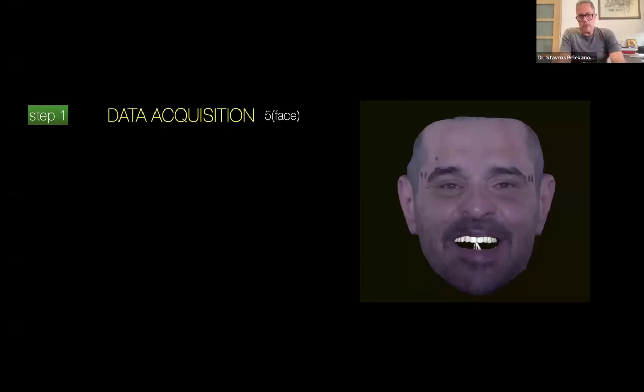So if we want to deliver a final design from day one, when we are doing the surgery, we need to be extremely accurate. I don't want to spend too much time when I do the surgery, which means I don't want to have any interference. I want to have an occlusion where maybe I don't spend more than 10 minutes. In the past, when we were doing immediate loading procedures, we were spending like 2 hours for occlusion.